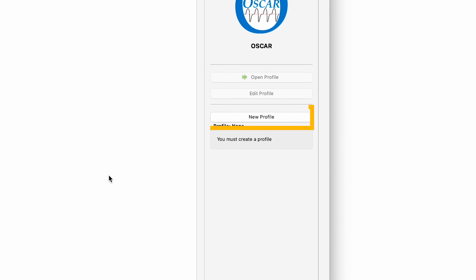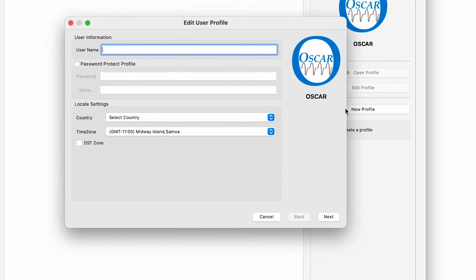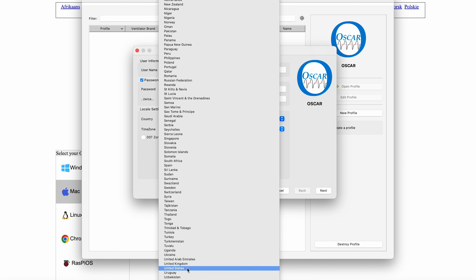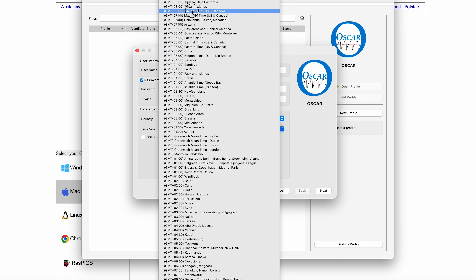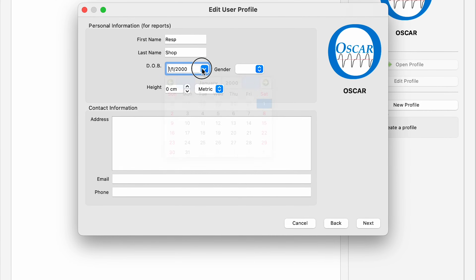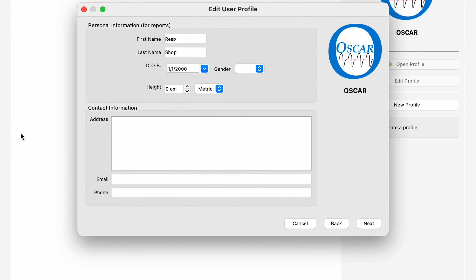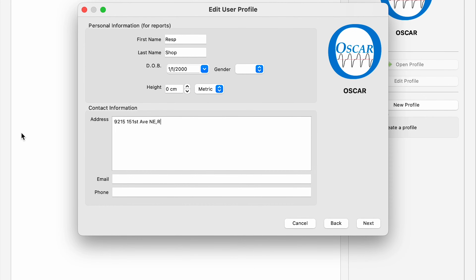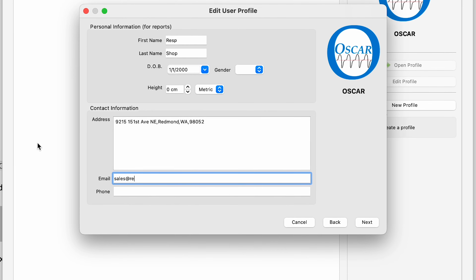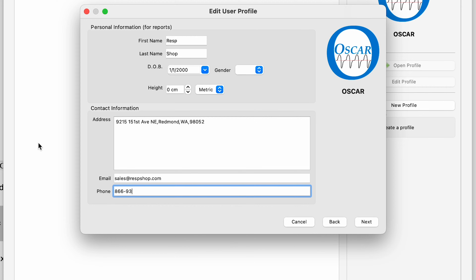When you open Oscar for the very first time, you'll first need to create your profile. To do this, click New Profile to the right of the window. It will ask you for a username, your country, and time zone, and whether you want to password protect that profile and what it should be. Make your choices and then hit Next. The screen after that asks for personal information like name, date of birth, gender, height, weight, etc. This data is only relevant to what gets printed out on your reports, so put as much or as little here as you want. It's all optional. Then hit Next again.